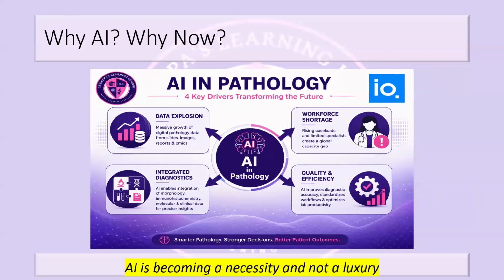But there are chances where an inter-observer variability can be there. For example, let's say you had a microfilaria. One microfilaria larva is somewhere at the tail end. One pathologist who is too worked up is looking at the data, and then suddenly they miss out looking at the tail at one point of time. And the observer just gives eosinophilia. One observer gives microfilaria.